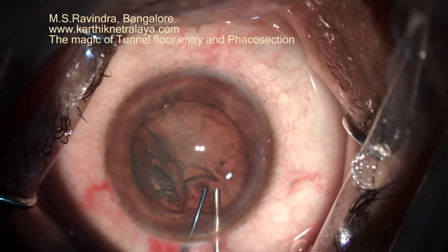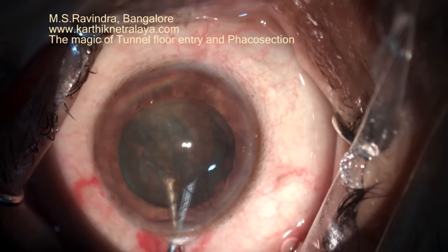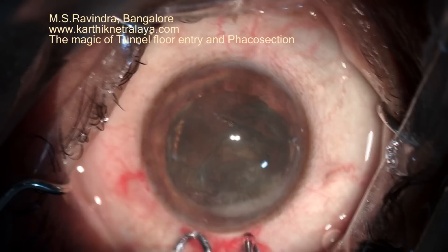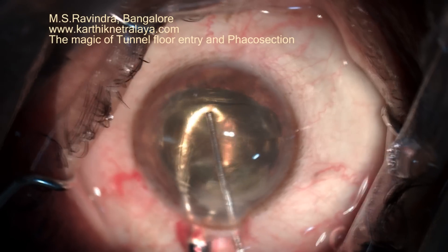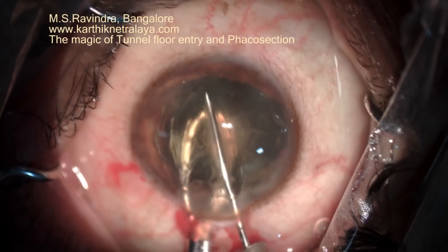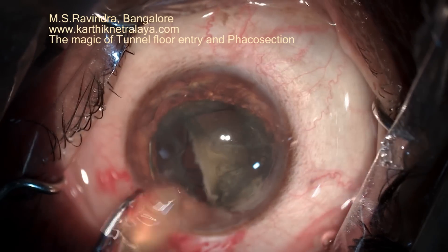A one-point hydro-dissection is created, separating the cortex from the capsule. The nucleus is now rotated along with the epinucleus into the anterior chamber, and to minimize the enlargement of the tunnel, it is bisected into three pieces and removed.